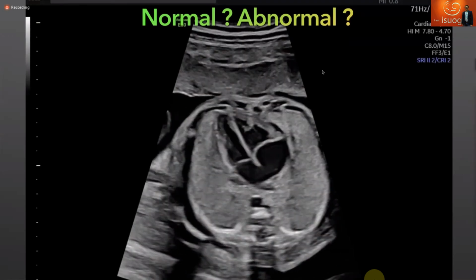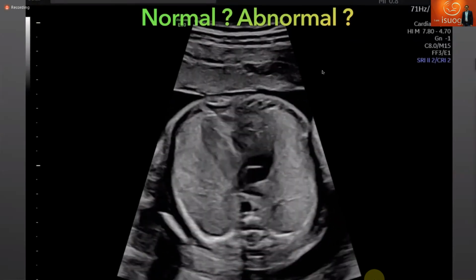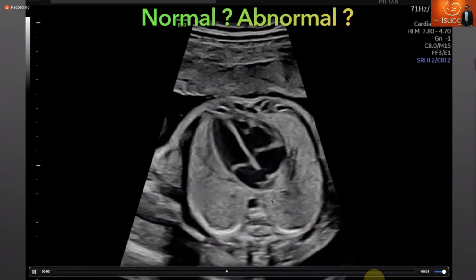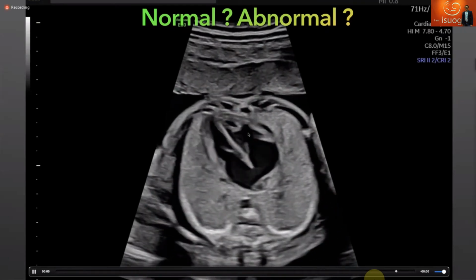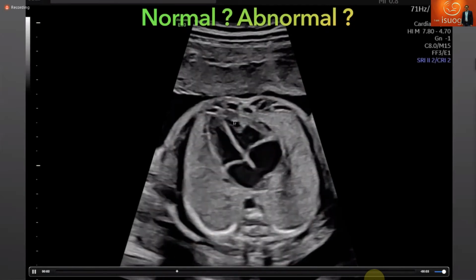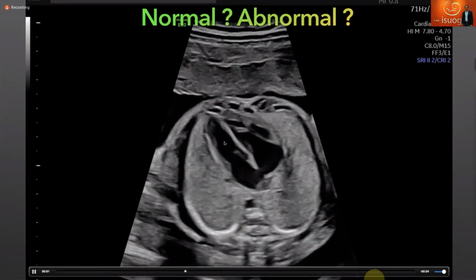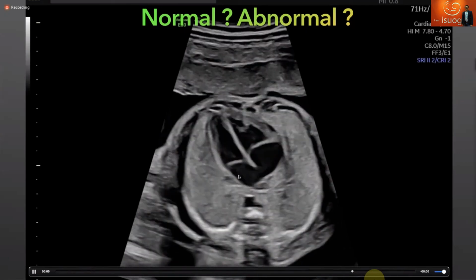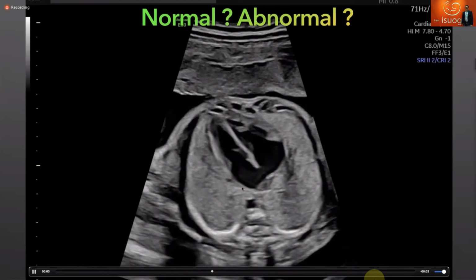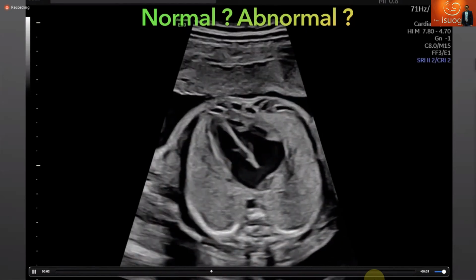This one is abnormal. Why is it abnormal? Look at now. So vertebra, this is the aorta, the right ventricle forming, it's typical, the apex of the heart is formed by the left ventricle. AV valves look okay, septum is okay. Look at the left atrium, look at the wall of the left atrium. Is the wall nice? Let's return back to show the other case.